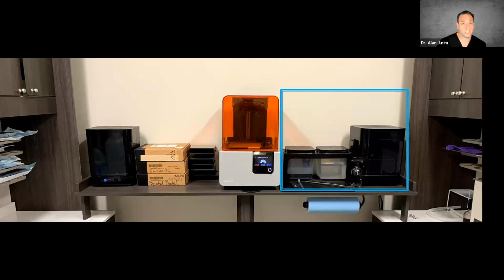Once the printing is done, we then have our wash baths. Now, what you see here on the right is the Form Wash, and we also have two tanks of just IPA that we use. We begin with the left tank, give it a quick rinse in there, then we go to the next tank, and then to the Form Wash. And the reason we do that, what I've learned is, rubbing alcohol, especially post-COVID, is very hard to come by. It's very expensive. So by keeping the baths separate and by going from dirty to less dirty to the clean bath, we end up going through less rubbing alcohol, less 99% isopropyl alcohol. And that's been a really good part for us, to make sure that the parts get cleaned well and we don't have to go through so much rubbing alcohol.